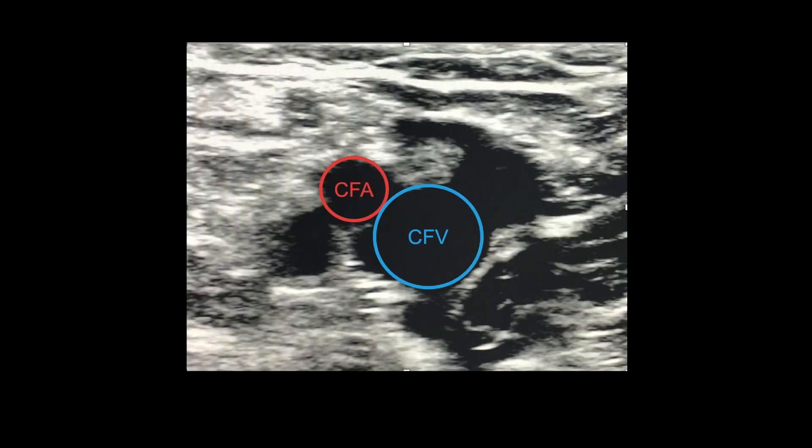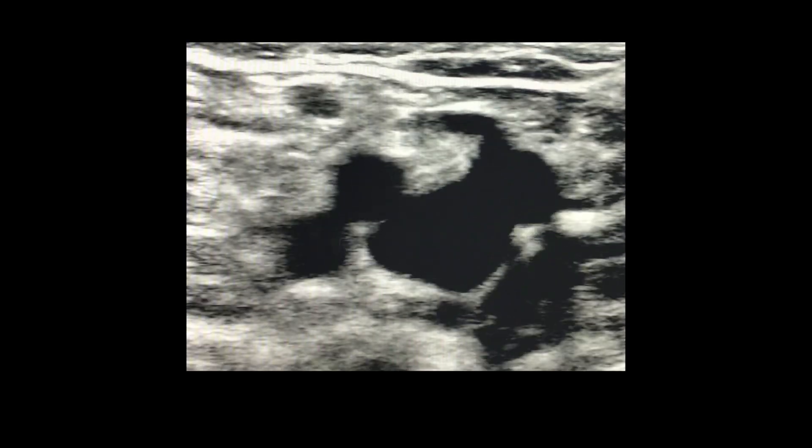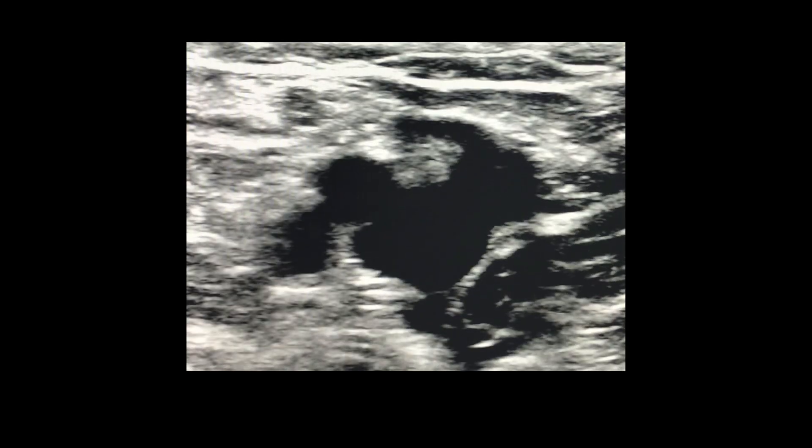This first video shows a fully compressible CFV, which means there is no thrombus present. You can see that only the artery, or Mickey's right ear, does not compress, which is normal.